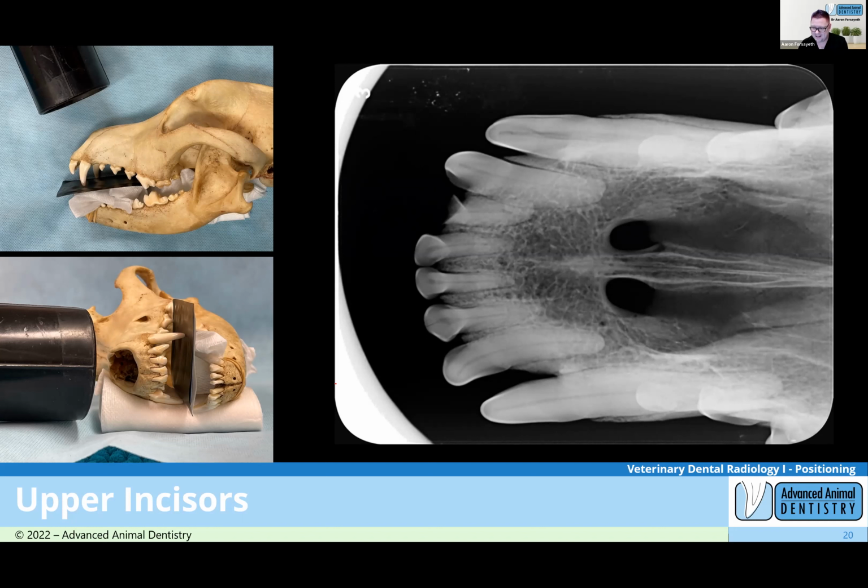We're going to rotate this image. Forgive me, we're going to talk about this tonight too. We don't normally orient the image on the right like that. That should not really be displayed like that.